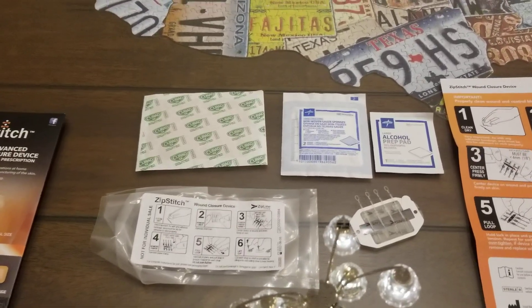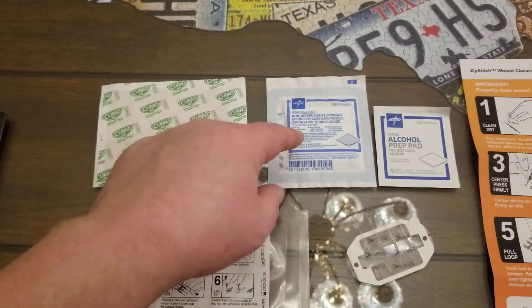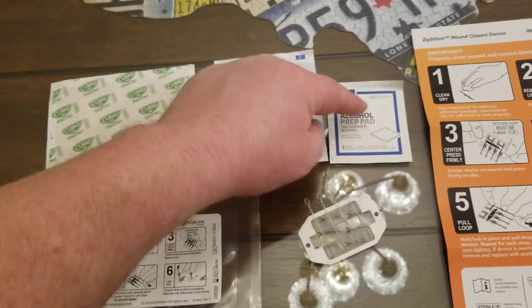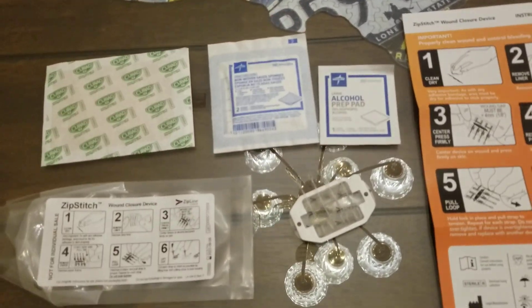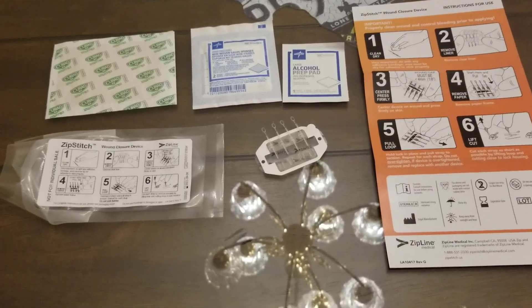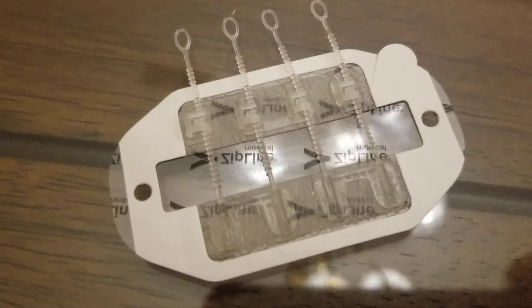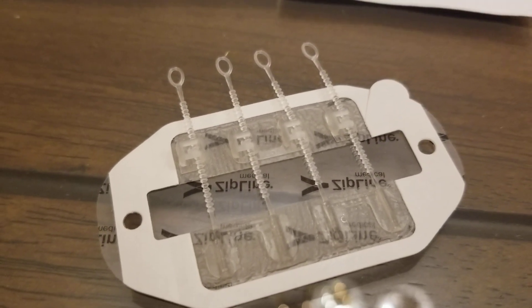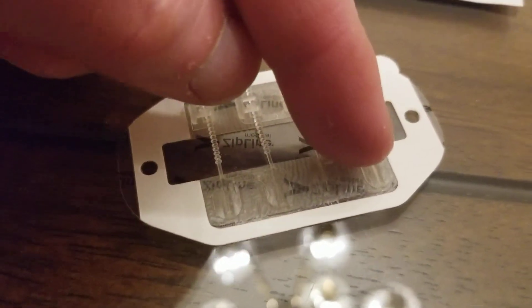First things first: you want to address the wound and use this gauze sponge to stop the bleeding. Once the bleeding is stopped, you take an alcohol prep pad and clean the area around the wound. Once it's cleaned and nice and dry, you're ready to get to the ZipStitch — and this is the cool part. I'm going to try to keep the camera zoomed in so you can see it.